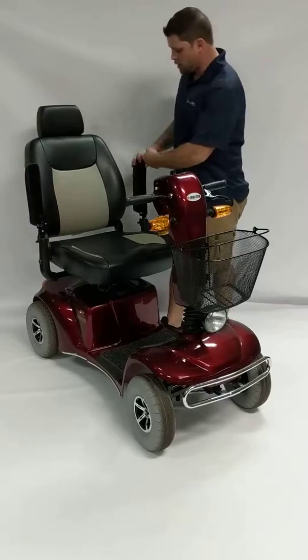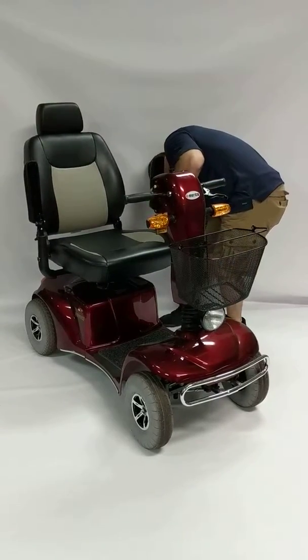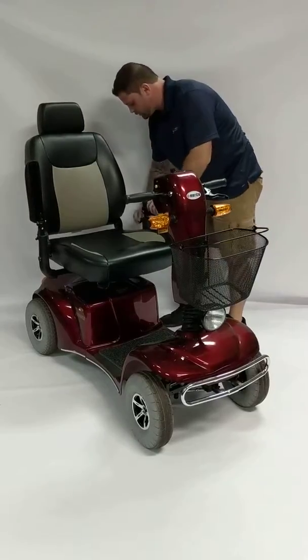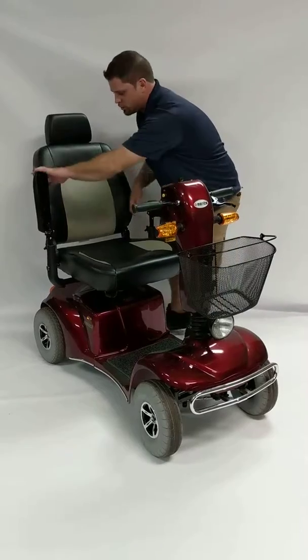Your armrests are adjustable. They can be taken off. They can be adjusted in height and locked in place just using thumbscrews on the sides.